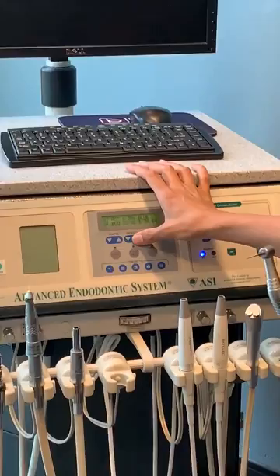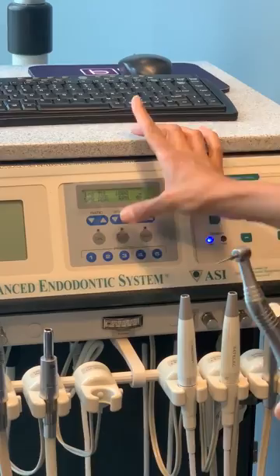I take my 25/06, put it in my rotary, and crank up the speed — all the way up to a thousand RPMs. Then I take this into each canal and start buzzing out all of that gutta-percha. I may not get everything out right away; I'll probably take out maybe half the length of the canal initially.